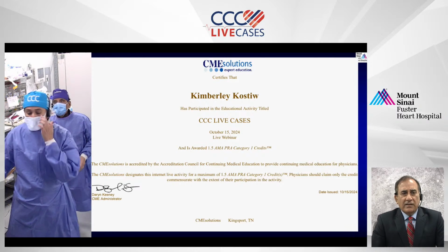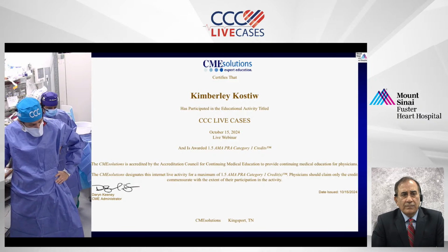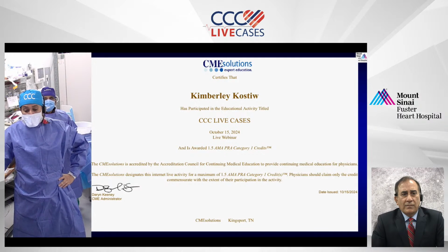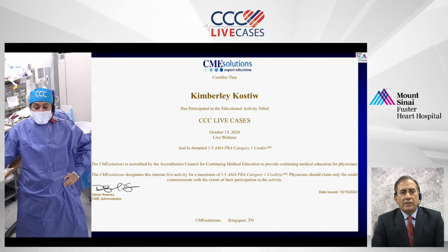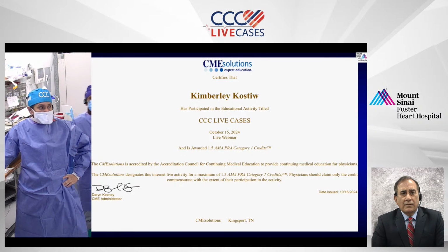With this, go ahead. You're making some additional comments. 1.0 for a CTO, yes. And timing, fluoro time is 23 minutes.